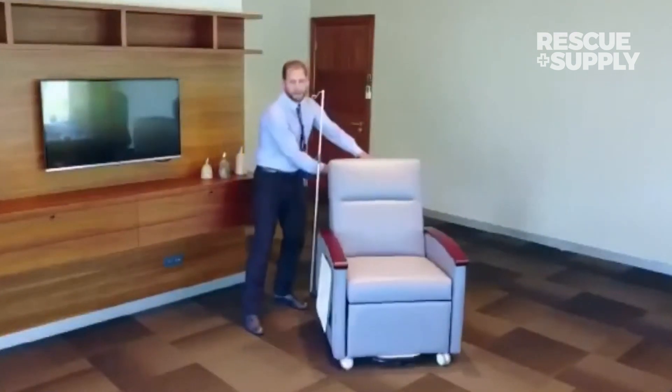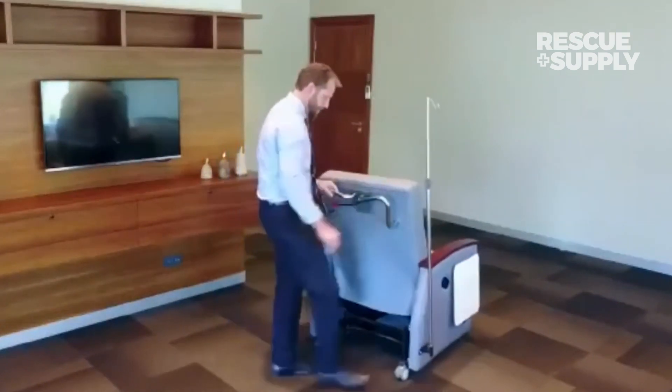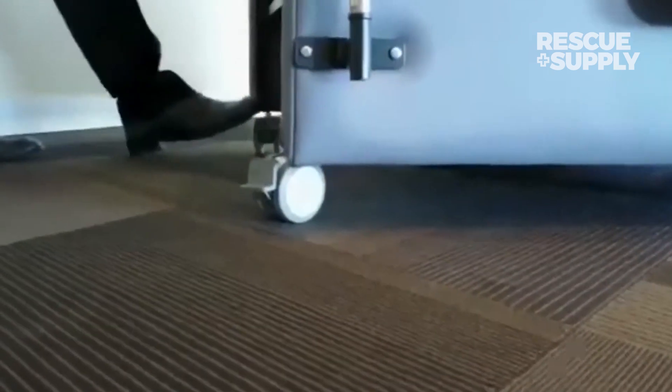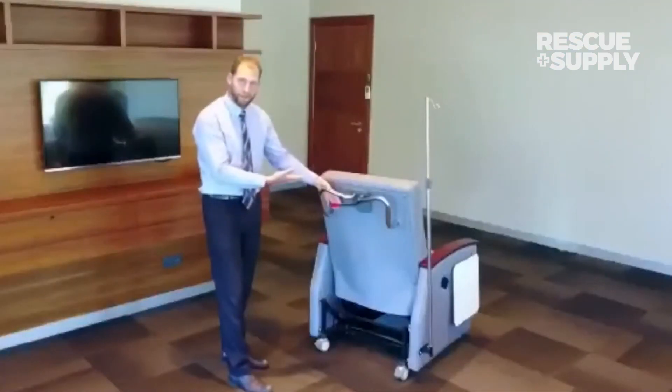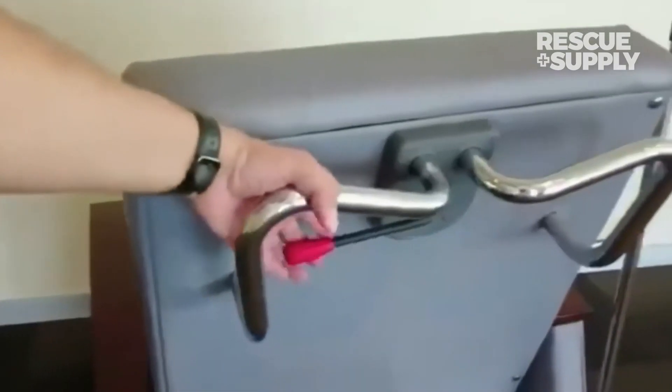On the casters, we do have locking casters of course — simply step and lock. There's also a CPR lever here that allows you to manually adjust for the patient when in seated position.